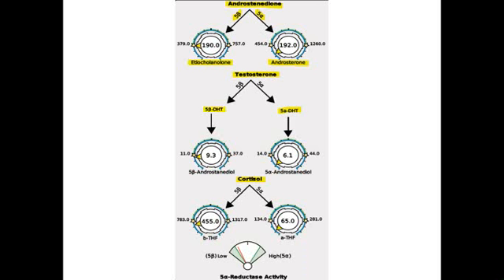And so we can see oftentimes a theme throughout this. For this patient, for example, the 5-alpha metabolite androsterone is lower within the reference range than etiocholanolone. We can see the same theme in the testosterone metabolites, as the alpha is lower than the beta metabolite. And again with cortisol, whose metabolites are not androgenic at all, it does show a similar pattern of these same enzymes that make alpha DHT and beta DHT, and in this one, similar to the other metabolites, we're making more of the beta. So the overall activity is a little bit lower on this one for 5-alpha reductase. We're actually favoring the 5-beta reductase.